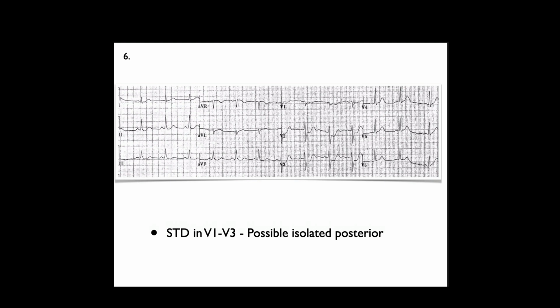Now notice that all of these things with ST depression, with the exception of reciprocal changes, we have to put "possible" in front. We don't quite know. We need to do more exploration, not all of which we can do. So on the final, do we need to include "possible" to get full points? Yeah, include it.